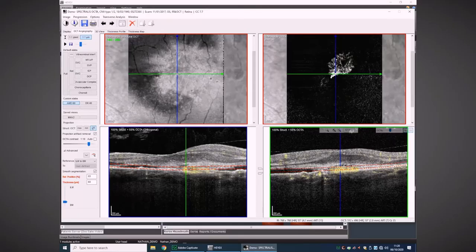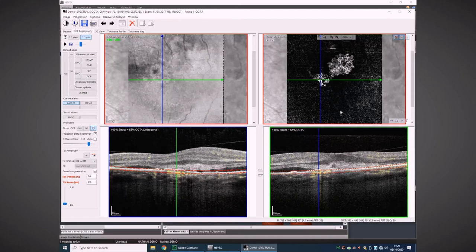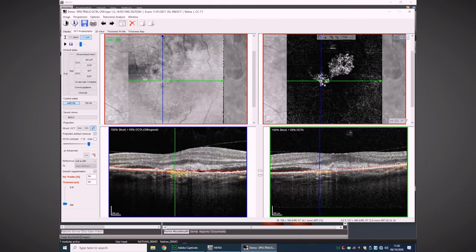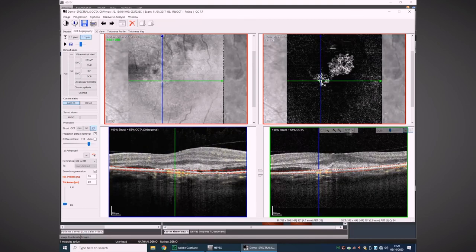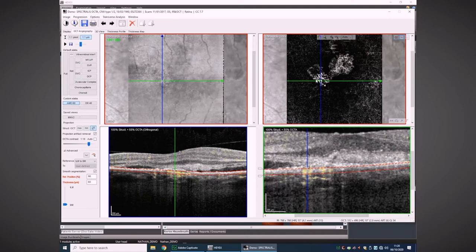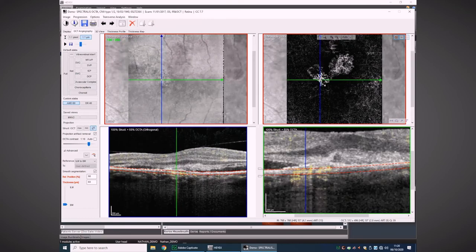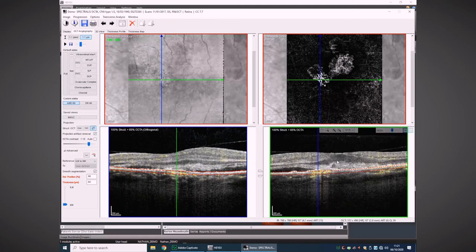Moving further down with our slab, we start to see a second area of flow, and if you look more closely and walk around it, you may consider this is possibly a type 1 — occurring below the level of the RPE, so an occult lesion. So we appear to have two types of lesion within the eye: a type 1 and a type 2. If you're really not sure, it's a very good idea to look three-dimensionally around the area to make your assessment.